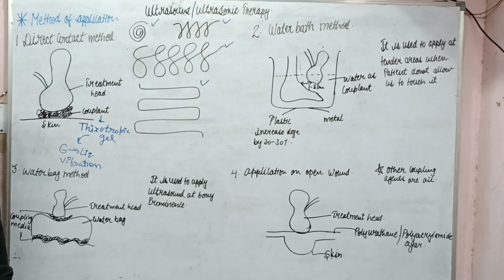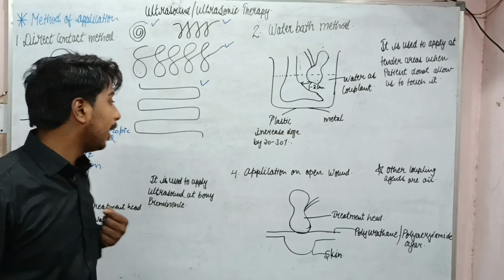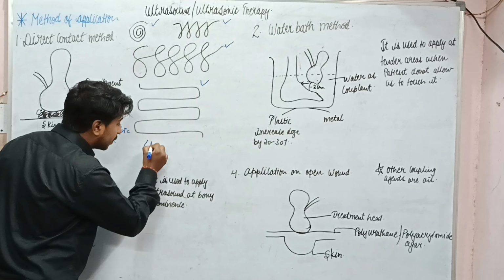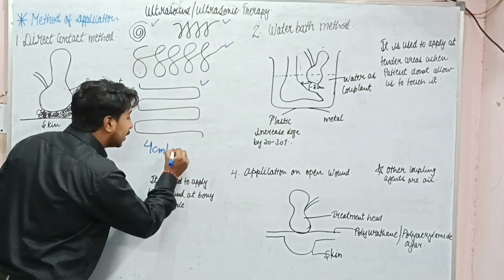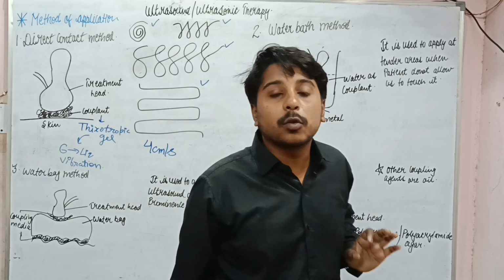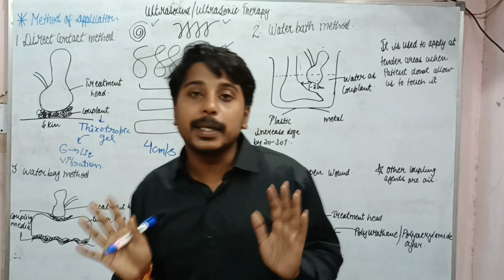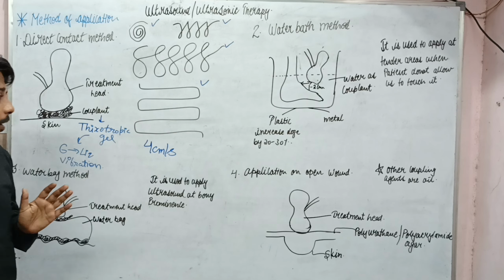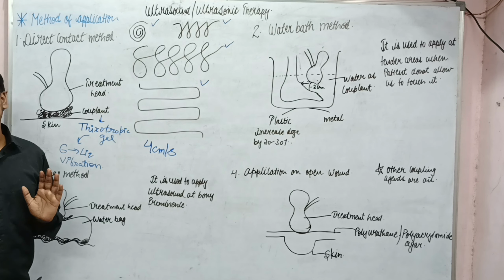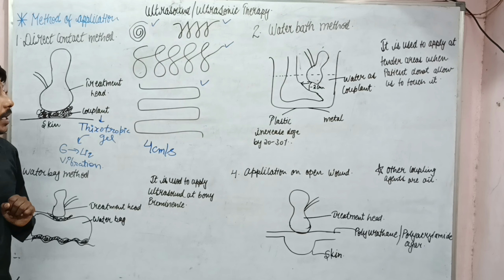You need to focus on the speed at which you are moving the ultrasound head. The standard speed is 4 centimeter per second. Okay, which is not too fast and not slow, which allows the ultrasound to penetrate inside the tissue for the various therapeutic effects. So this is the first method of application.